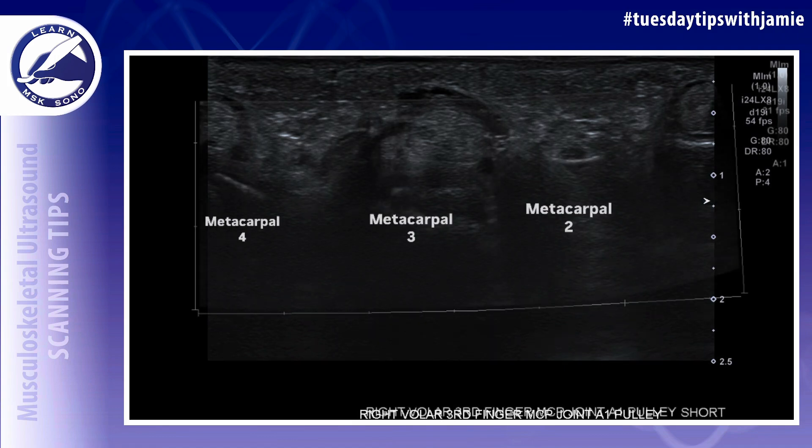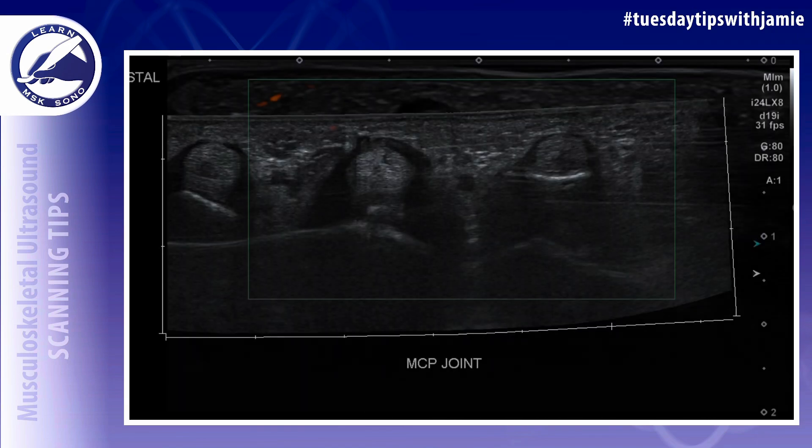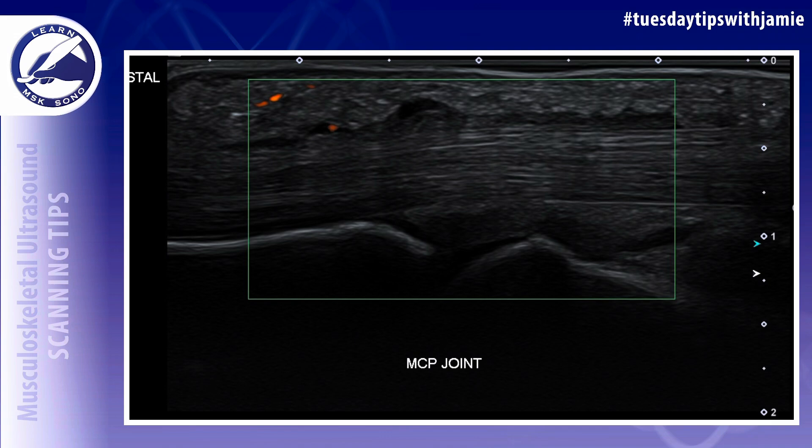It should also be compared to the adjacent pulleys using the extended field of view feature, comparing it to the adjacent pulleys at the same level. The volar aspect of the MCP joint should be assessed as well for the presence of hyperemia using power Doppler.